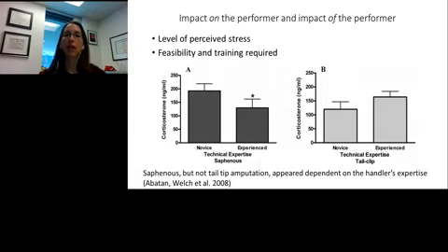The different phlebotomy techniques vary in how feasible they are and the amount of training required. Some of these techniques require using just anatomic landmarks to do a blind puncture where you can't see the vessel that's your target. Some of them require holding the animal in a more difficult position. And so some of these can be more or less stressful as perceived by the person who's going to have to be actually doing this.